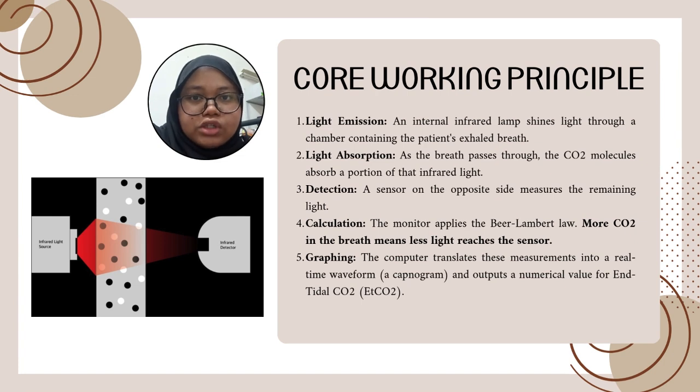The first one is light emission. An internal infrared lamp shines light through a chamber containing the patient's exhaled breath. Number 2 is the light absorption. As the breath passes through, the CO2 molecules absorb a portion of that infrared light. Number 3 is detection. A sensor on the opposite side will measure the remaining light.